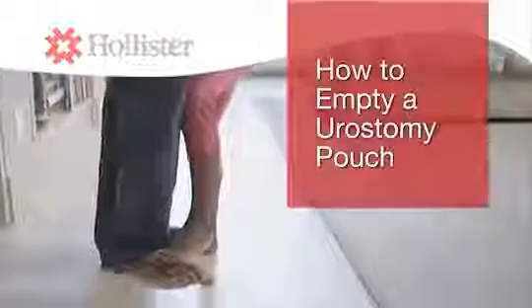A urostomy pouch will have a spout or tap at the bottom. Only urostomy pouches have this feature.